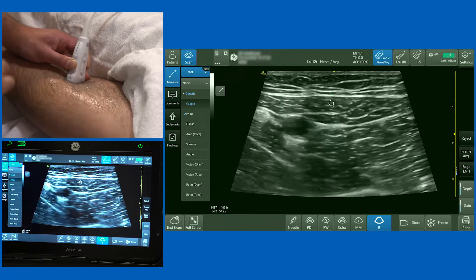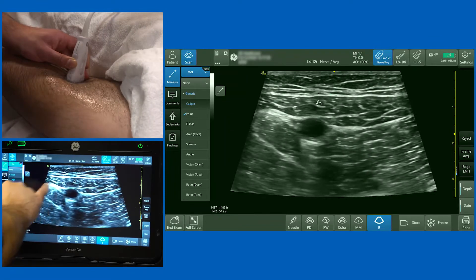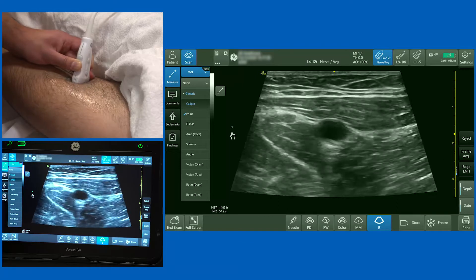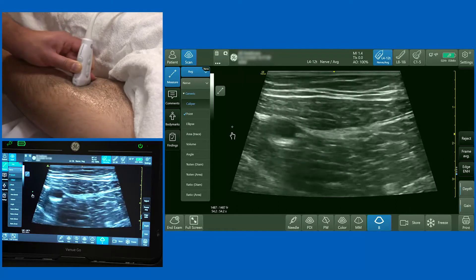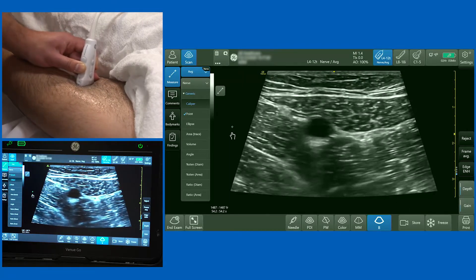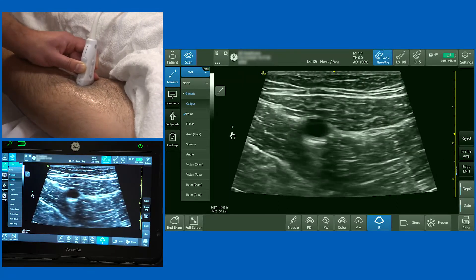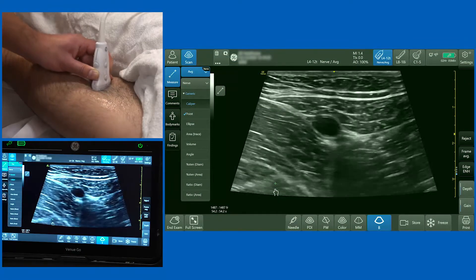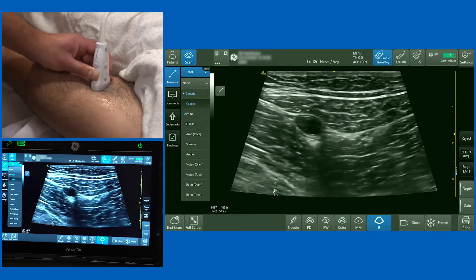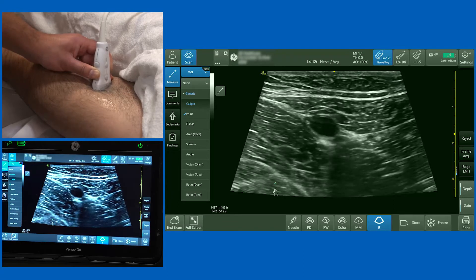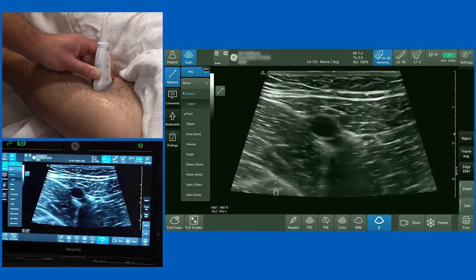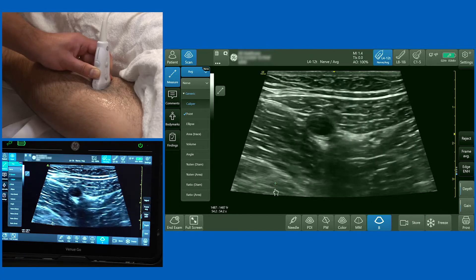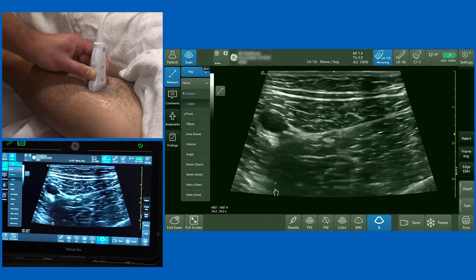One more tip to orientate yourself correctly: there's a structure involved with knee analgesia which is important not to miss, and that's the nerve to the vastus medialis. In order to optimise your injection point, it's worthwhile identifying the apex of the femoral triangle — that's the true injection point for this block — because it ensures that you get the nerve to vastus medialis.